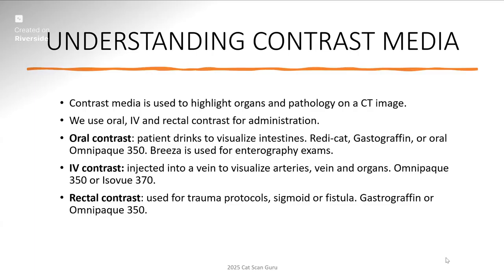Now, Breeza is what we use as well for enterography studies, and I know MRI uses Breeza as well. We used to use VoLumen, but VoLumen was phased out, so Breeza is the method of choice now. Now, we also do IV contrast. Usually oral and IV contrast go hand in hand, unless it's the emergency room. Usually we just do IV only, unless there's a specific reason why the ordering ER doctor wants oral contrast to use on their patients.